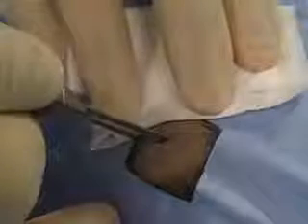Make a short 5mm linear stab incision. Use of a retractor is usually unnecessary. Ask an assistant to secure the patient's head. Place the drill perpendicular to the skull and turn the handle clockwise. Do not lean on the drill.